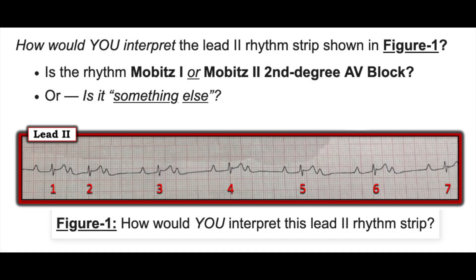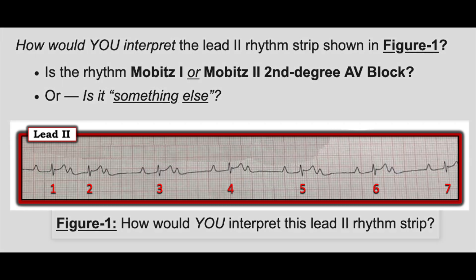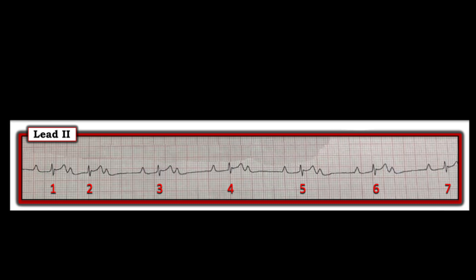Here is the rhythm. How would you interpret this rhythm? The choices are: sinus rhythm with blocked PACs, AV dissociation, complete AV block, second degree AV block Mobitz type 1, or second degree block Mobitz type 2. How many think it's complete AV block?